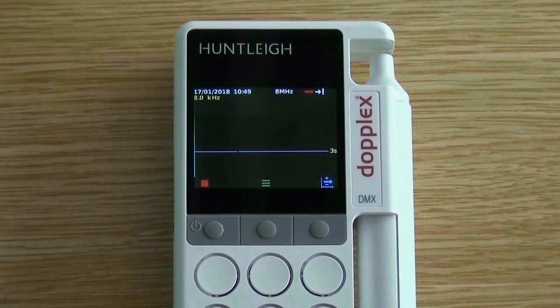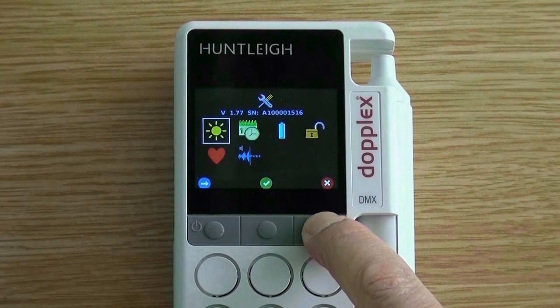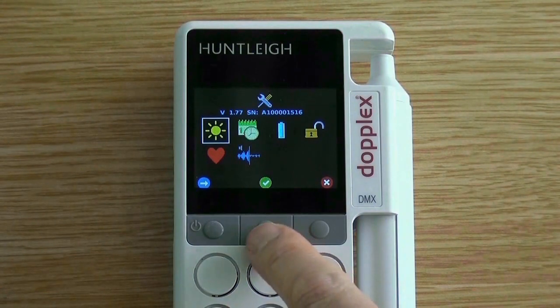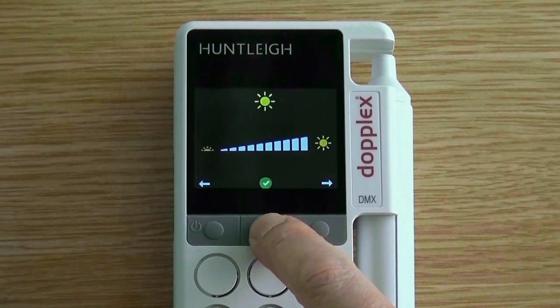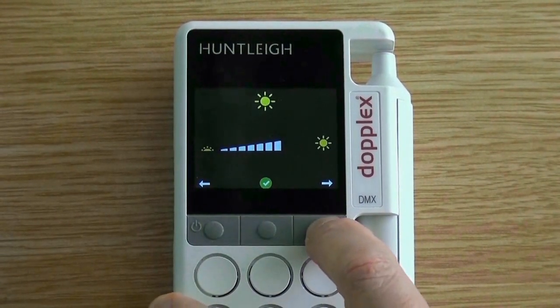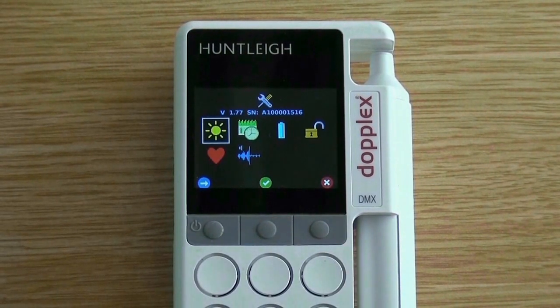Enter the setup screen by pressing the right button for three seconds. With the brightness symbol highlighted, press the middle button. Use the left and right buttons to increase or decrease the screen brightness, then press the green tick to accept.